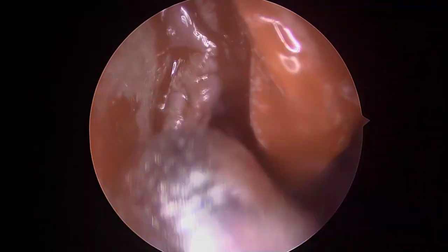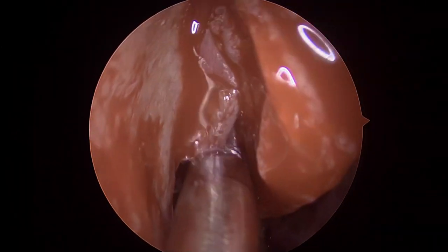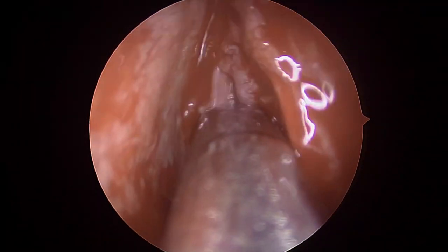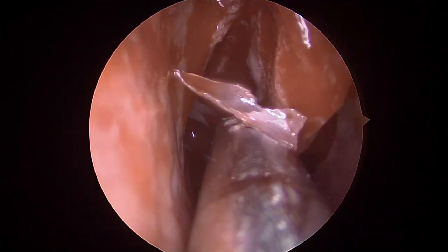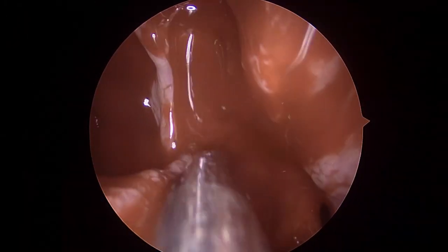And now I have everted the polypoidal uncinate process and also gotten the glimpse of the bulla with its attachment to the lamina papyracea, and hence I can confidently debride the vertical portion of the uncinate process. So uncinate process has mucosa, bone as well as mucosa, and as you can see, after debriding the mucosa, I have gotten the vertical portion of the uncinate, and you could also see a glimpse of the mucosa lying behind the bone.